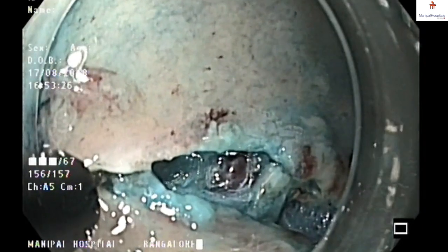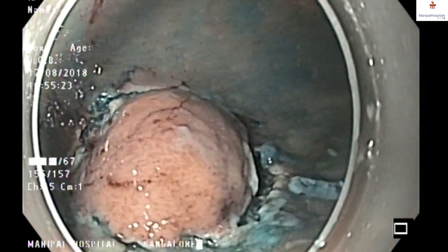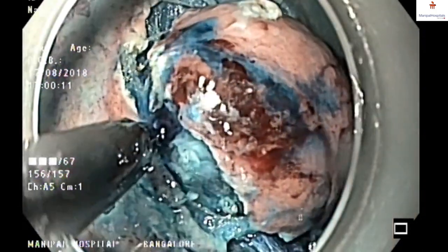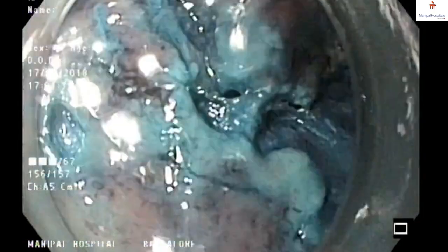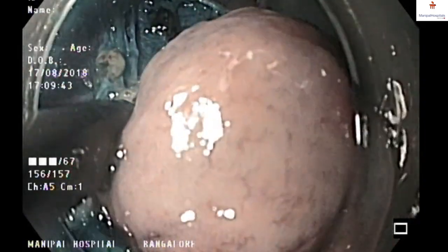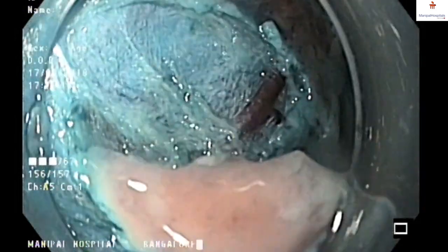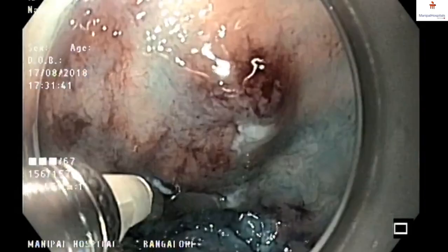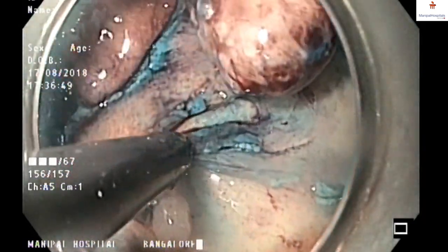Recently I performed ESD — endoscopic submucosal dissection — removing a tumor from the fundus of the stomach. As you can see the tumor in the fundus of the stomach, I marked the surrounding about one to two centimeters away from the tumor and then injected the tumor so it is lifted up. Then I started the dissection and removed the tumor en bloc and sent it for pathological examination. As you can see, there was a small vessel which I have clipped.